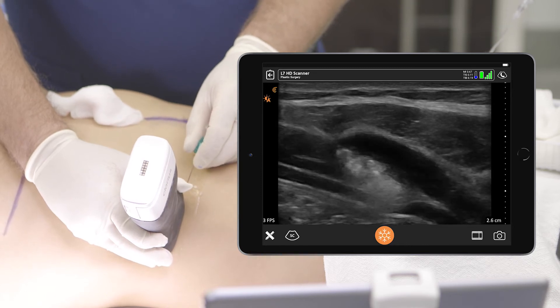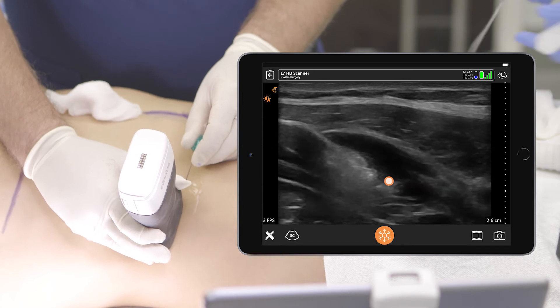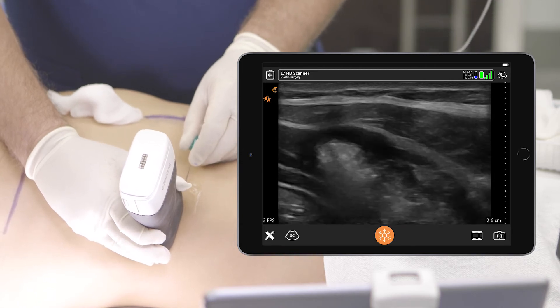Now I'm in the internal so I'm going to back up and go a little further. Test dose again. There we go. That little bit of flash that you saw was in the internal, and now I'm in the correct plane.